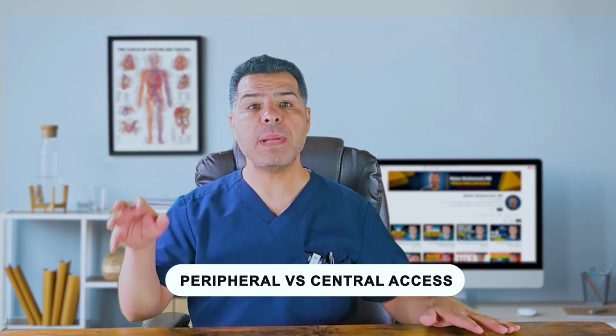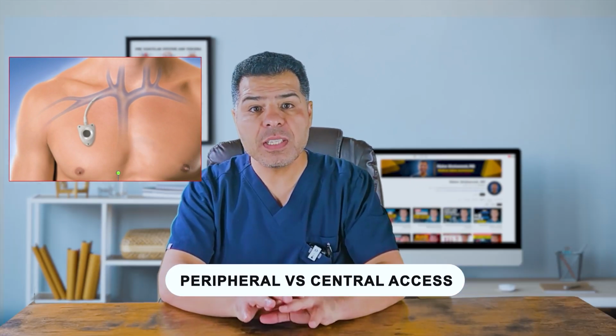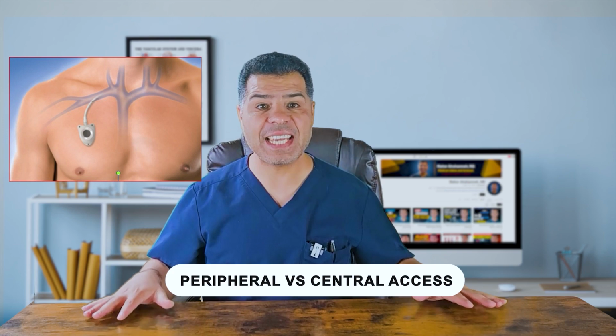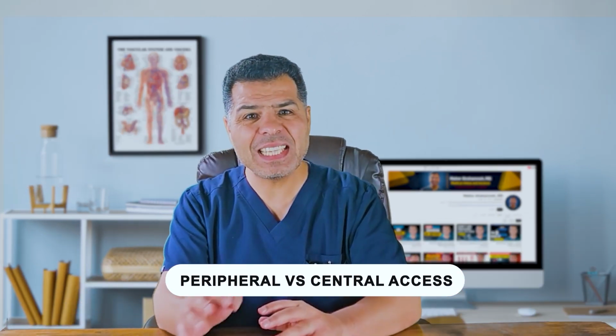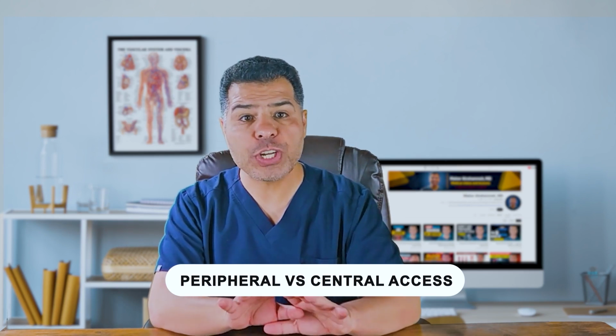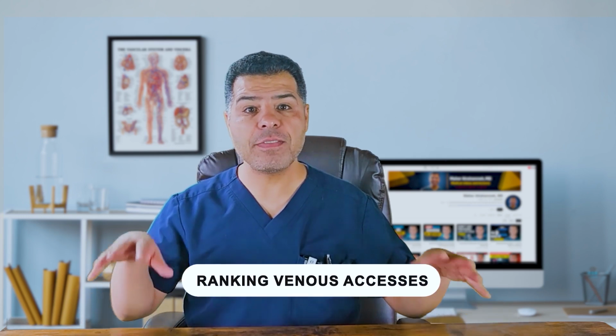And finally, implanted ports, also called porticath. That's one of the brand names. These are fully under the skin catheters. They are accessed only when needed, require very little day-to-day care, and can last for years, often permanently when maintained well. Let's rank these lines in a few different ways.